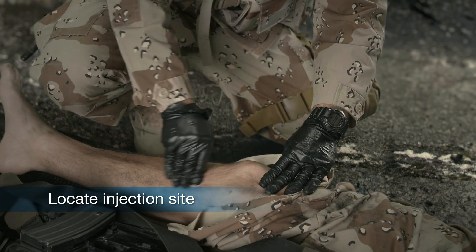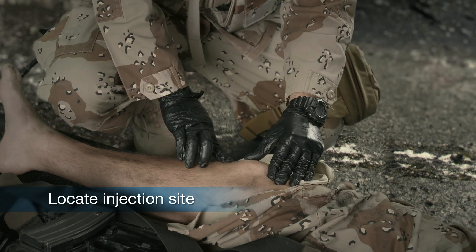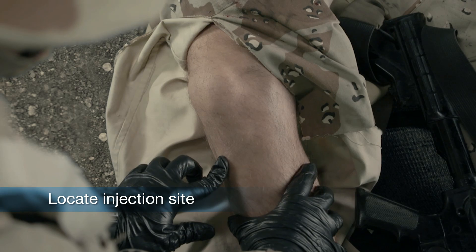To locate the injection site on the tibia, palpate down from the kneecap toward the foot until you feel a rounded protrusion.